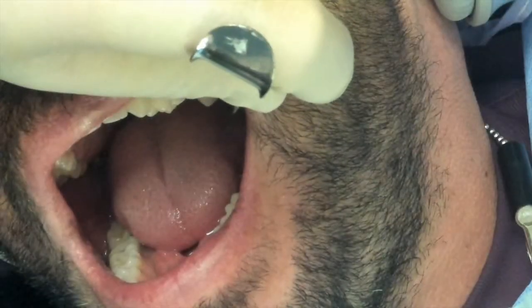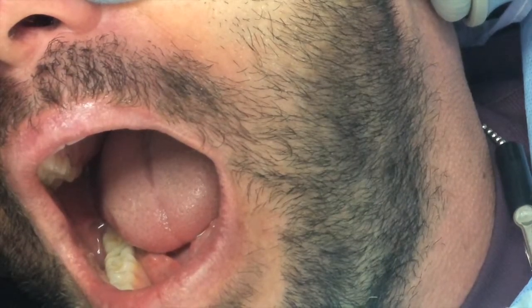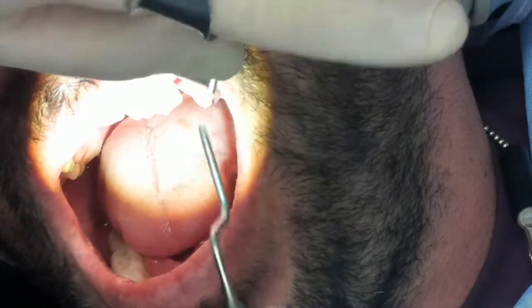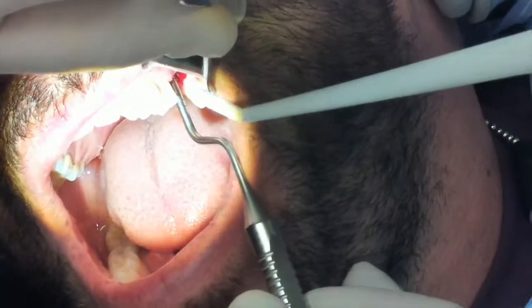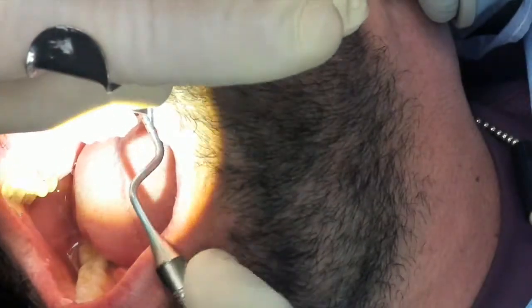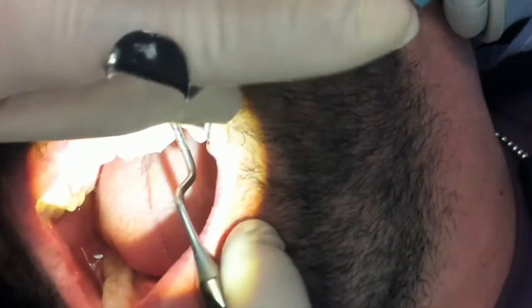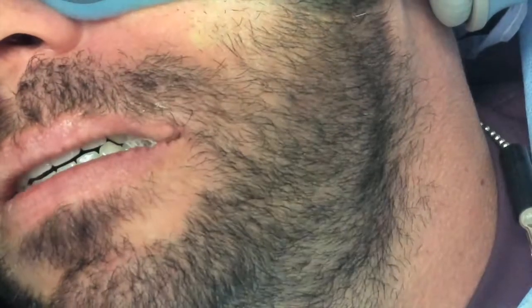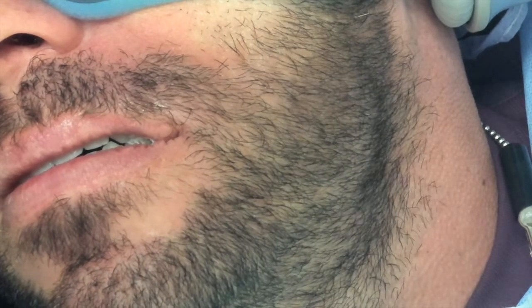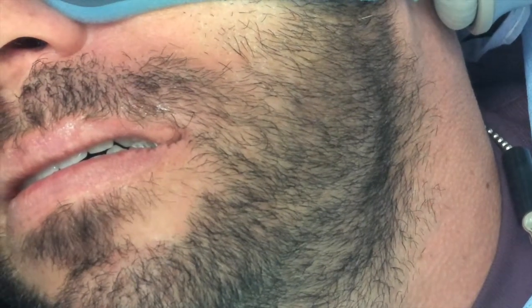So what I'm going to do now is go over here. This is my 2.6 millimeter osteotome. First level down, second level is 10 millimeters. So I'm just going to go in, suctioning towards me a little bit, Matt. There we go. I'm going to feel around the bone a little bit, widen the site. And I'm right at that floor of the sinus. Let me push on it. Pressure on that. So we're not at that point yet where I want to go into. Right now I'm at the floor of the sinus, but right above where I'm at is a septum that I'm going to have to kind of increase through. So we're going to widen the osteotome up a little more. We're going to do that right at the very end.